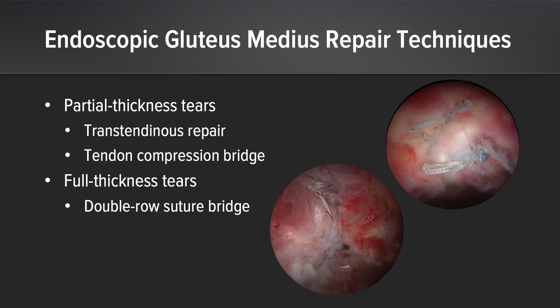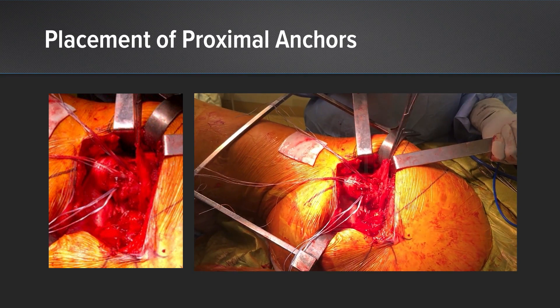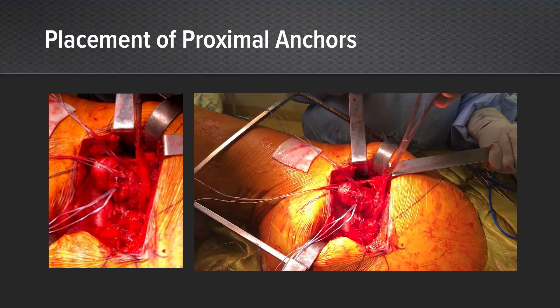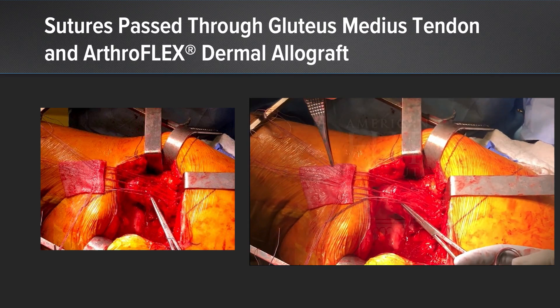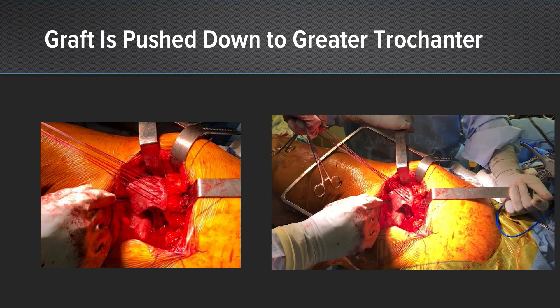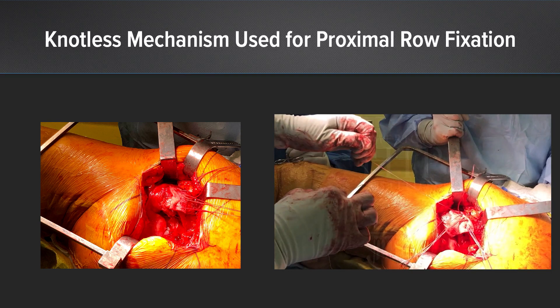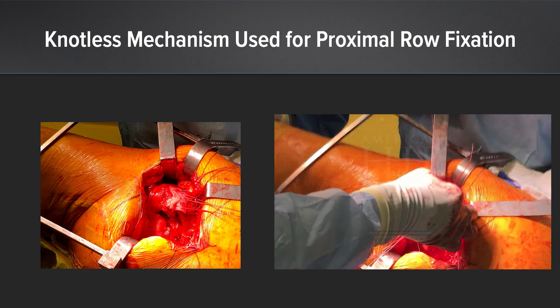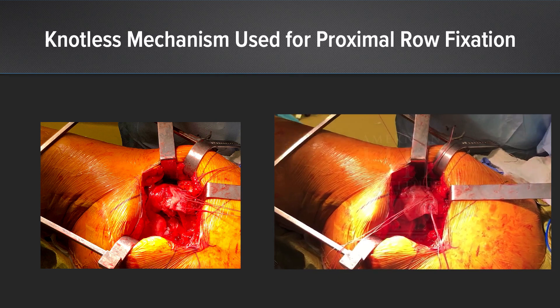Here is an example of a full thickness atrophied or retracted gluteus medius tear treated with a double-row compression suture bridge with acellular dermal allograft. We are gripping the tendon in the video. We have passed the sutures through the gluteus medius tendon and the arthroflex graft. The swivel lock anchors allow us to compress the entire construct with the tendon and the graft using knotless mattress stitches. As the graft is pushed down onto the greater trochanter, we set up to fixate the graft and tendon construct with the knotless mechanism from the swivel lock anchors in the proximal row. Each mattress stitch compresses a part of the tendon and graft complex against the bone. The graft itself acts as a ripstop for the mattress stitches, especially valuable where there is insufficiency or atrophy of the tendon tissue.